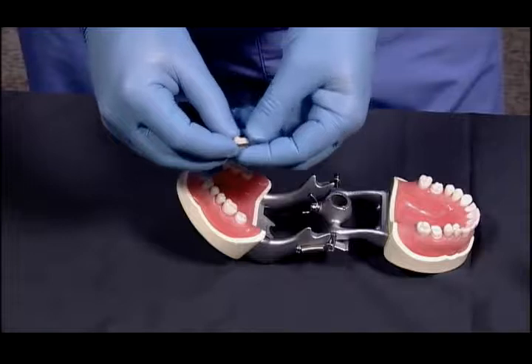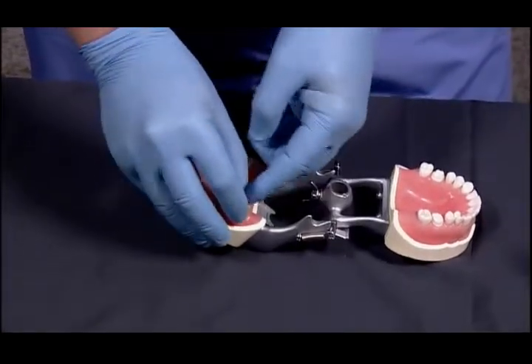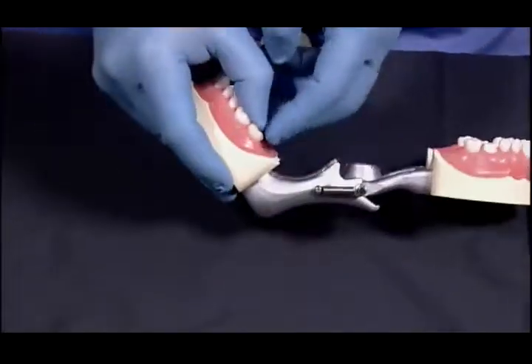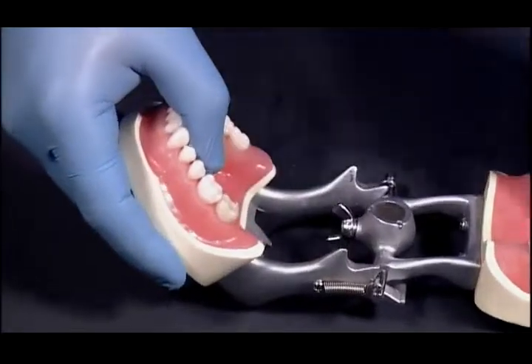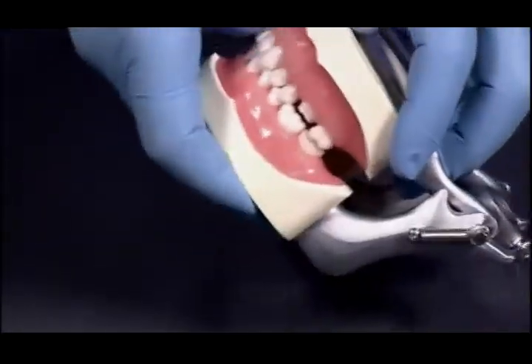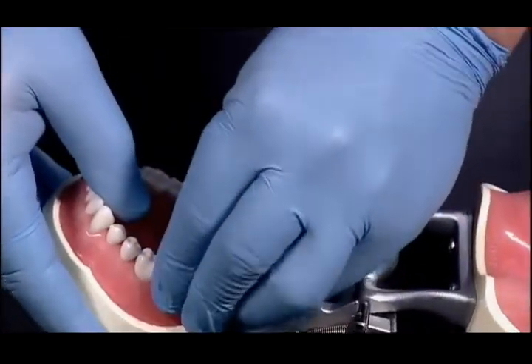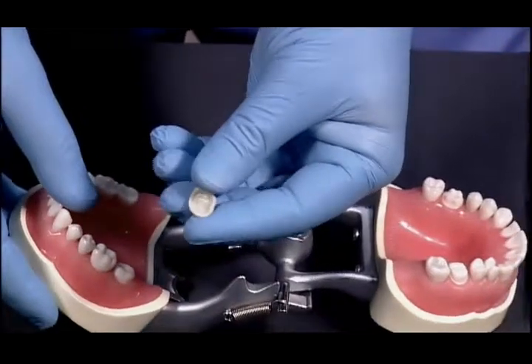When you return from the lab with the finished and polished restoration, you try it back in the patient's mouth, making sure that all of your margins are nicely adapted, your interproximal contacts are fine. Check the bite, make sure that you can get into full maximum intercuspation, and you would now cement it in place with a good temporary cement.